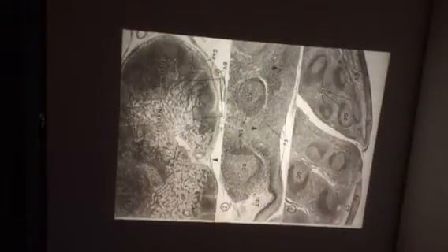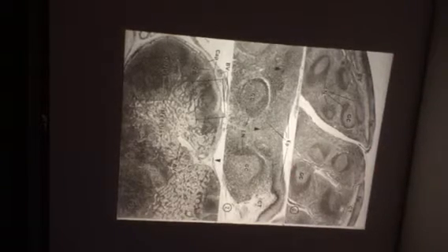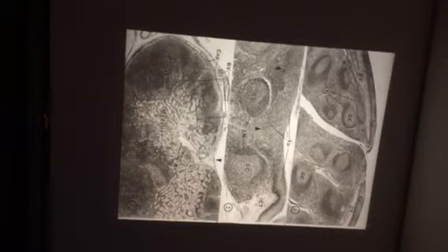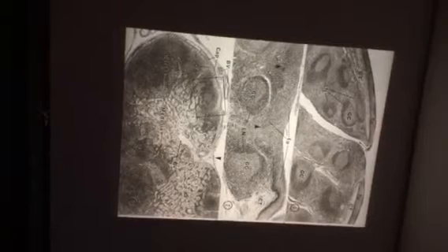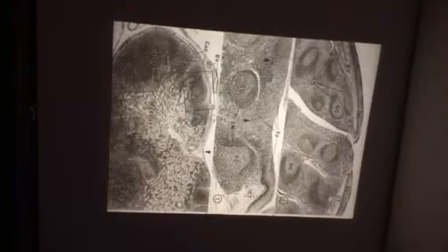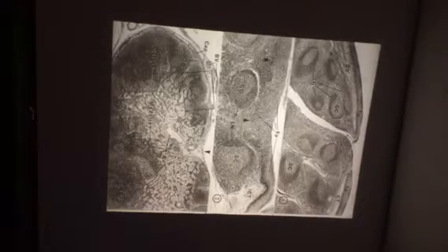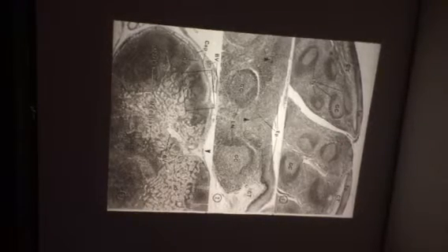Okay, and this organ right here, palatine tonsil. I'm not going to put the lingual tonsil on the lab practical. So if you see a stratified squamous epithelium and you see lymphatic nodules with germinal centers, and you see these deep structures right there, which are called crypts, that would be palatine tonsil.